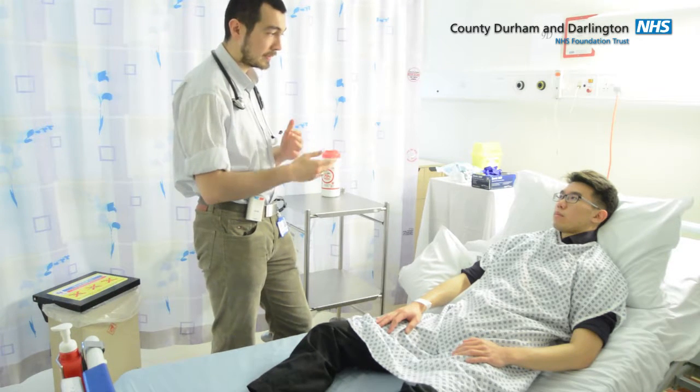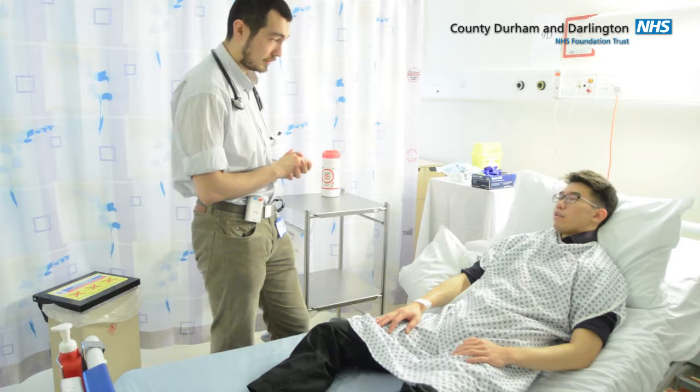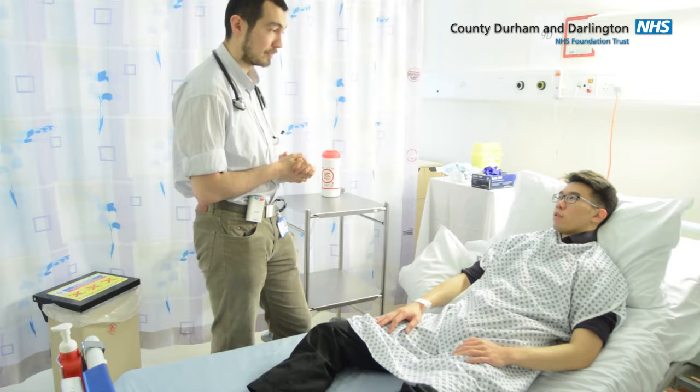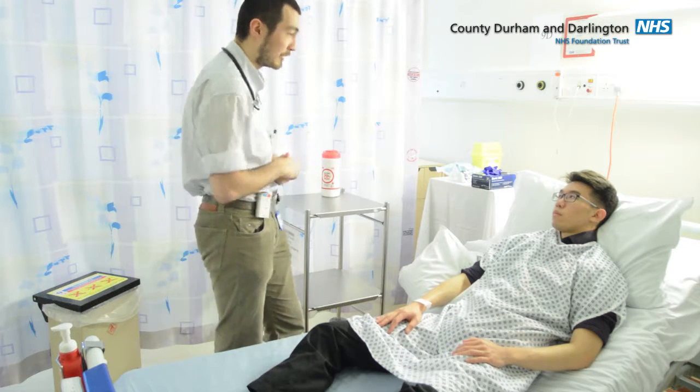Okay. And have you had your blood taken before? Yes, I've had my blood taken before, yeah. And do you have any needle phobias? No, not at all, not bothered. Excellent. So I'm just going to prepare my equipment. Sure.